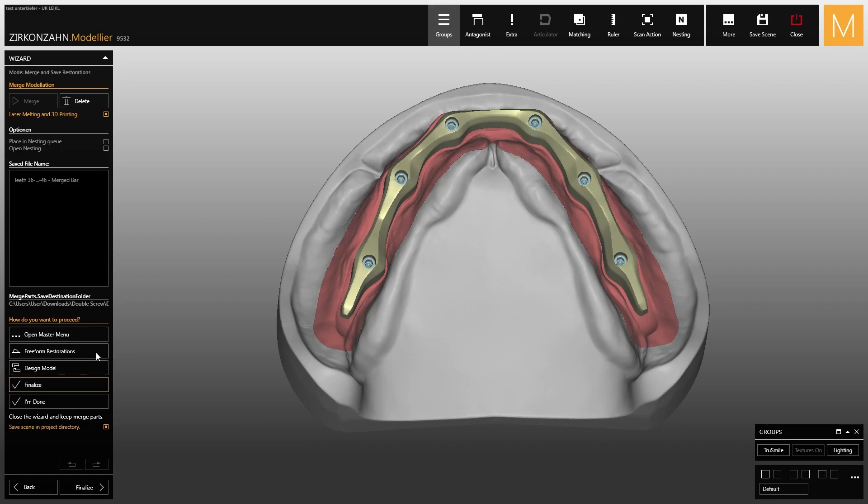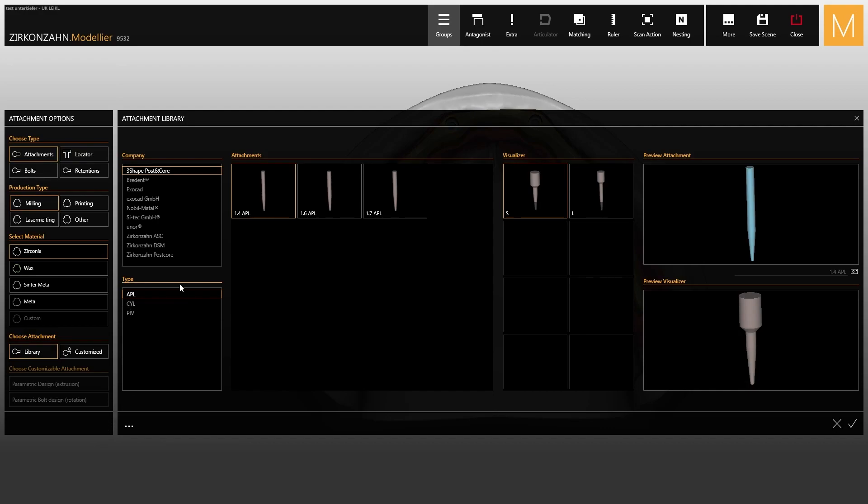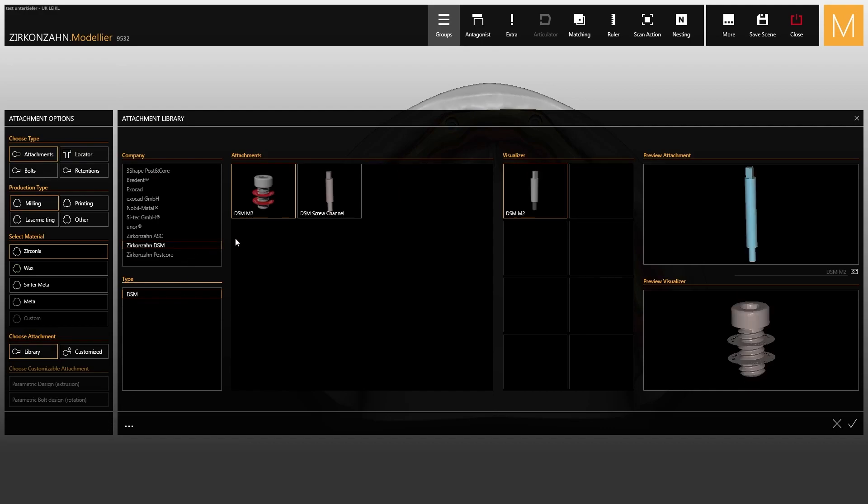After that, go to the finished parts modeling function and open the attachment library. Here you will find the DSM attachment group containing two different objects. In this first step, select the first attachment on the left, with the screw and the visualizer.